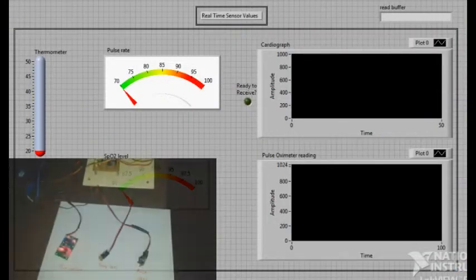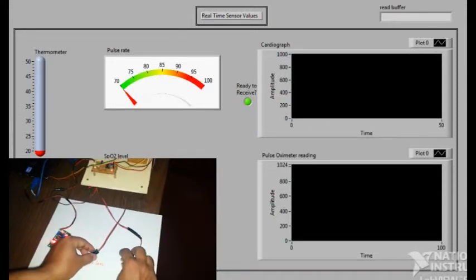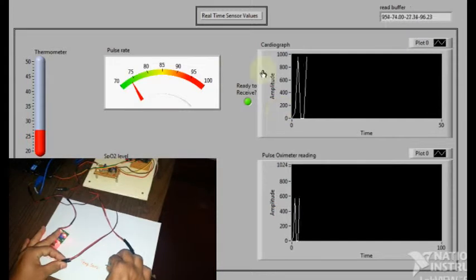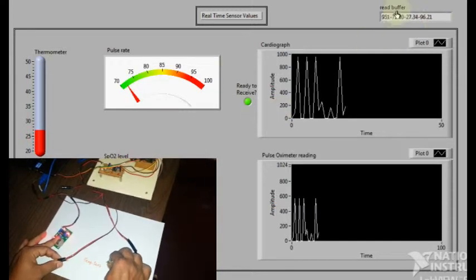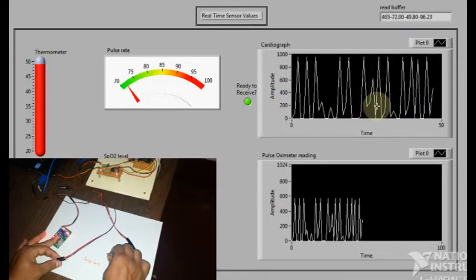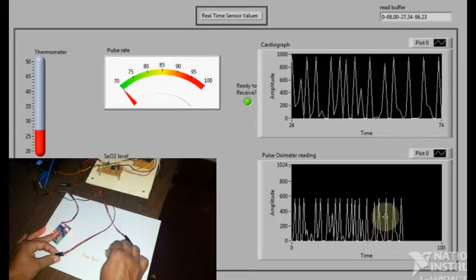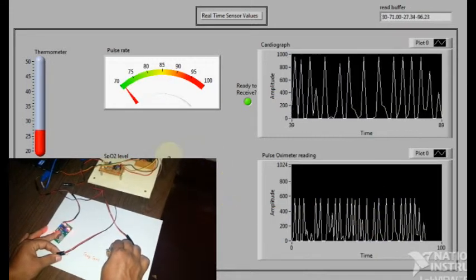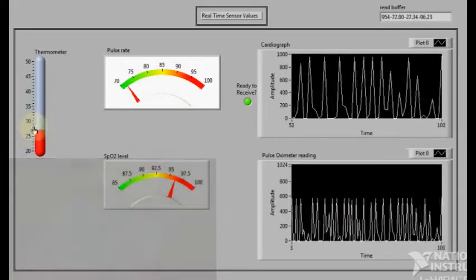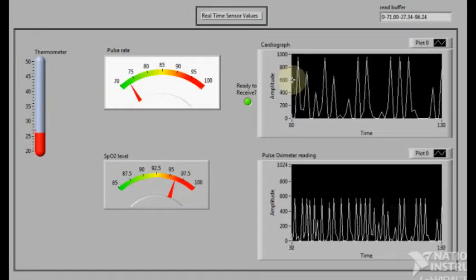Moving on to the maintenance phase, LabVIEW ensures that the sensor probes are connected by signaling using an LED. LabVIEW continuously receives the sensor values from the microcontroller and displays the parameters after calculating them. The body temperature is measured using the LM35, which is a linear centigrade sensor.